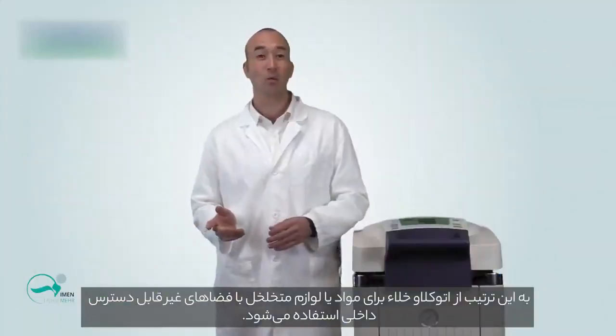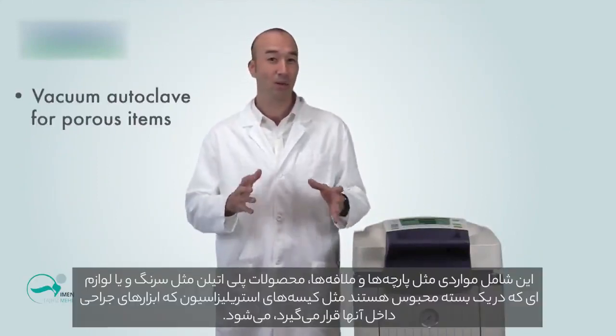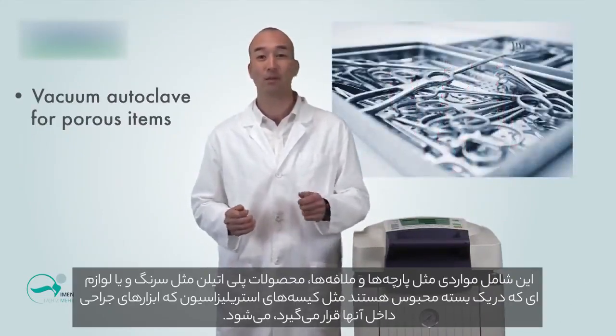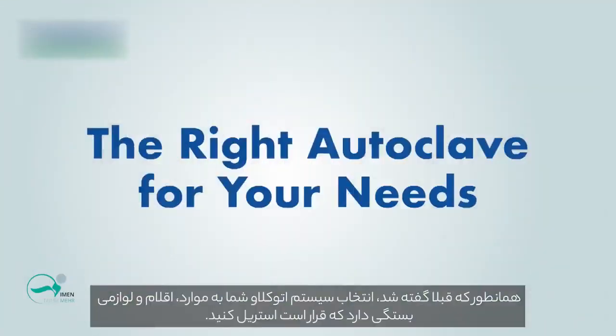As mentioned, you'll want to use a vacuum autoclave with porous items or items that have hard-to-reach spaces. This includes, but is not limited to, fabrics and bedding, polyethylene products such as syringes, or wrapped dry items that have air trapped inside, such as sterilization pouches that contain surgical tools. As mentioned earlier, your choice of an autoclave system will depend on the items that you'll be sterilizing.